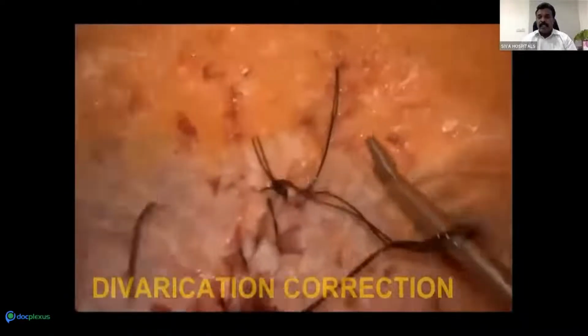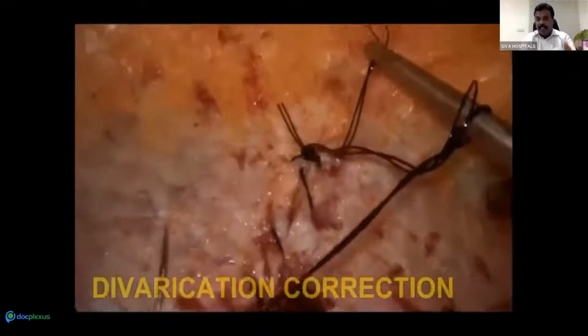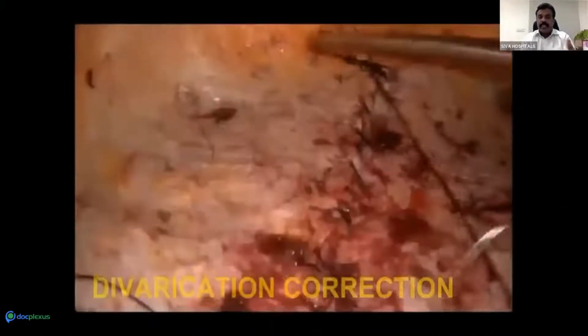Now you can see the midline. There is the linea alba. A new linea alba is made. So the only thing now is augmentation with the mesh.